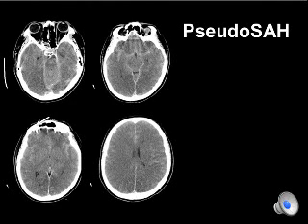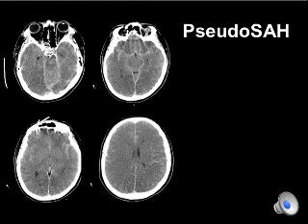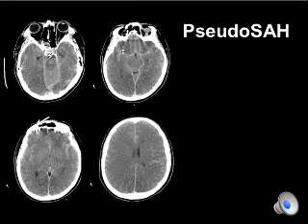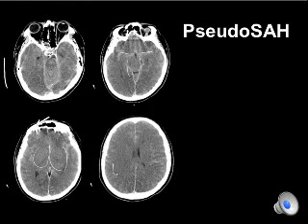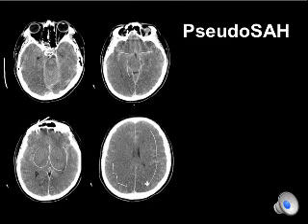Finally, remember that not everything that is bright on CT in the brain is necessarily blood. In radiology, we're looking at contrasts — when something appears bright, it may be that the adjacent structures are dark. This is the pattern of pseudo-subarachnoid hemorrhage: it seems there is blood in the subarachnoid spaces, but actually the abnormality is the brain tissue that is too dark and hypodense. You can barely see the basal ganglia and there's no gray-white matter differentiation. This, together with a characteristic clinical history of cardiac arrest and unsuccessful CPR, tells you that you are dealing with pseudo-subarachnoid hemorrhage.